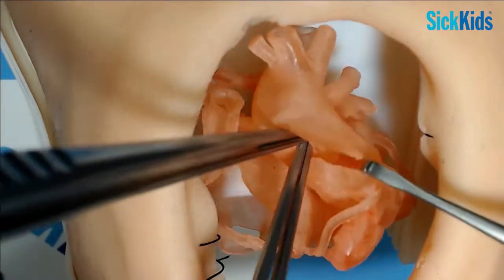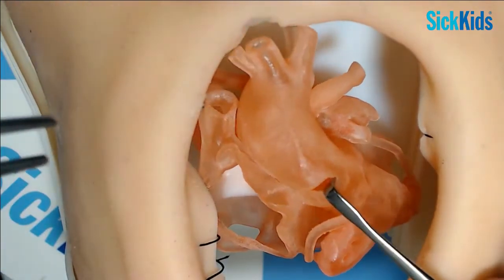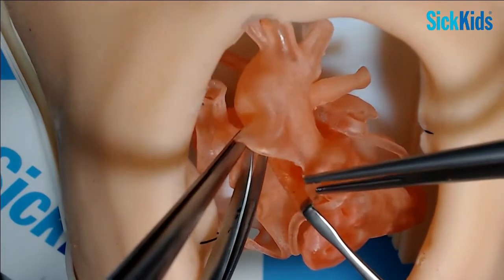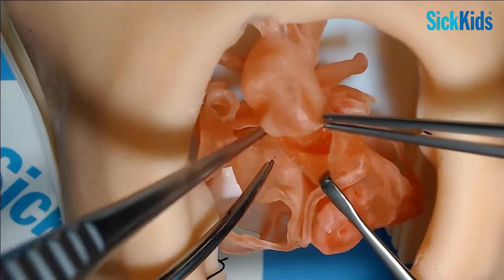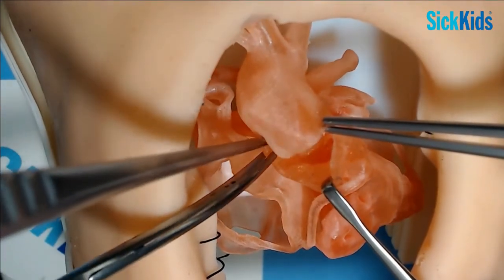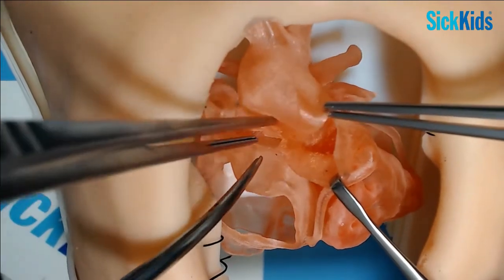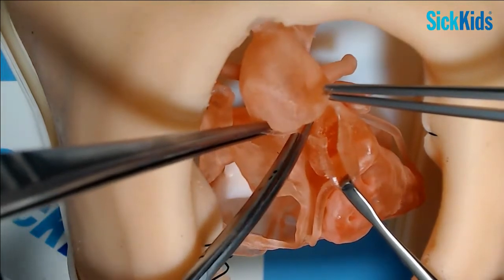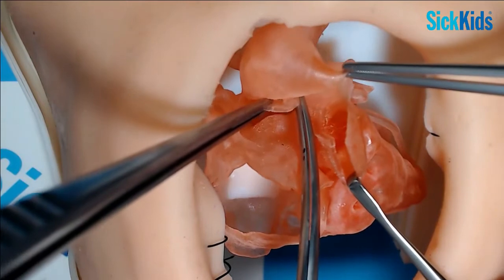There's one there, and here's the other there. So we should be able to take them off on a kind of button. And you want to try and just keep a little bit of tissue around. I'm okay, I think, with these. And they're quite favourable in the sense they've almost got a common origin. As you said, they come together almost like a pair of spectacles. But you want to take a nice cuff so you've got a good cuff of tissue to work with.